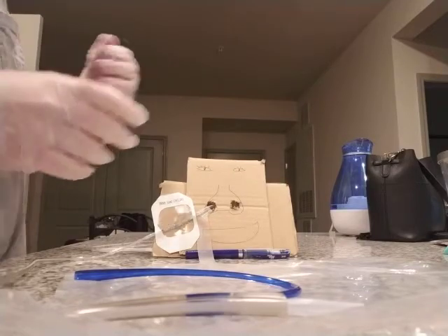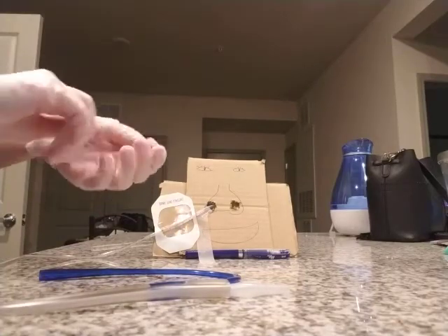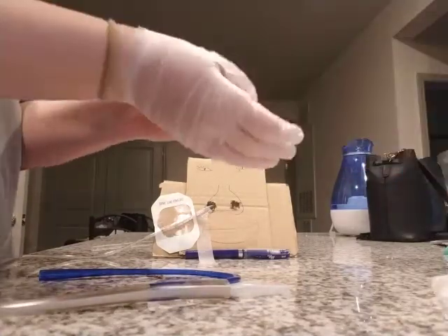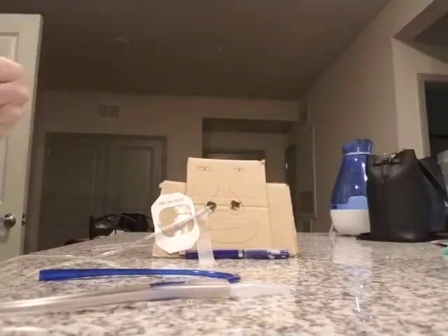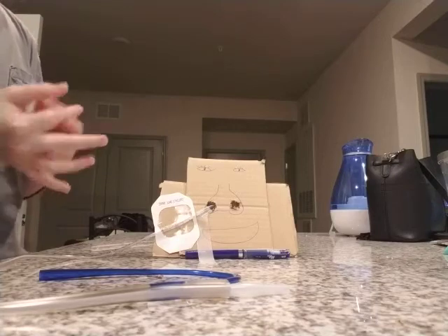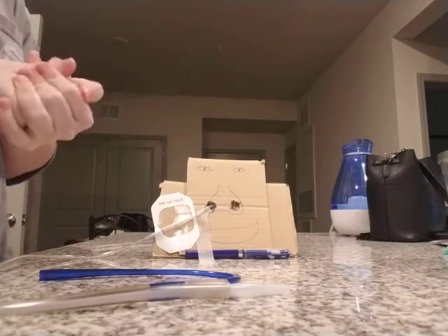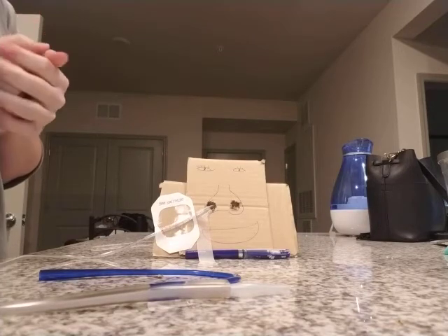I'm now going to gather up all my supplies, and I'm going to remove my gloves, dispose of those as well, and perform hand hygiene again. We're going to assess the patient's comfort level, assist them into a comfortable position, and document the procedure and outcomes, and how many milliliters of sterile water I used, which is 10 milliliters.